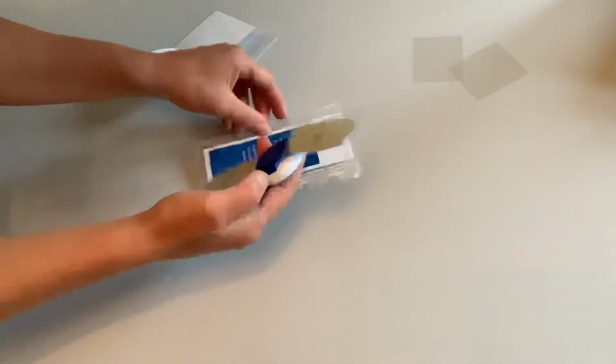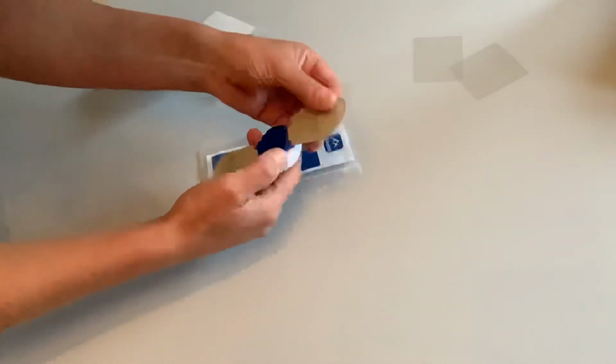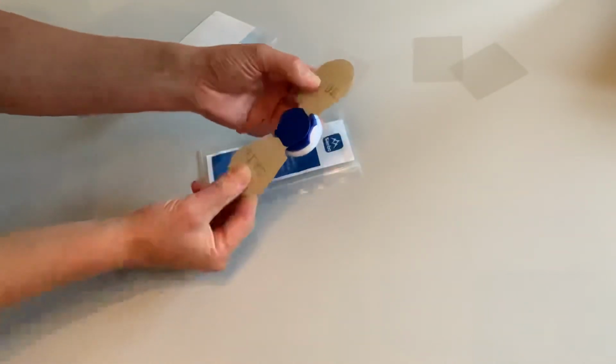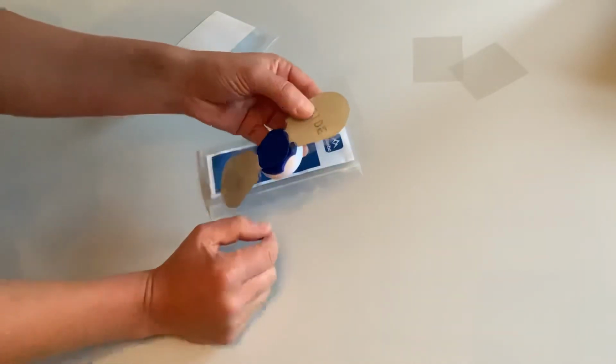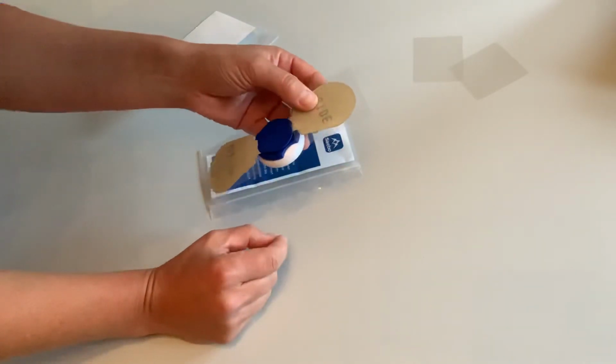When the gel pads have had 10 or 12 uses, they'll dry out and not be as effective, and that's when you want to peel the whole gel off and replace with a new gel electrode.